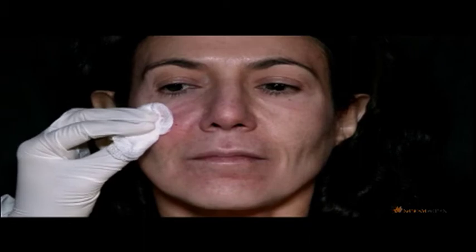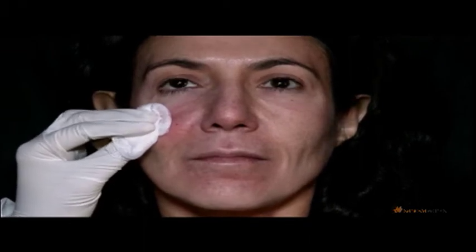The other area that I like to volumize straight off the bat is the piriform region. This is up at the nasolabial angle. I like to come in slightly from the side because we have to be aware that the angular vessels are here. So we're injecting slowly here. I'm looking out for any blanching. I don't use epinephrine with my lidocaine. The reason being that if I see blanching, that's a sign to me that there may be some vascular compromise.